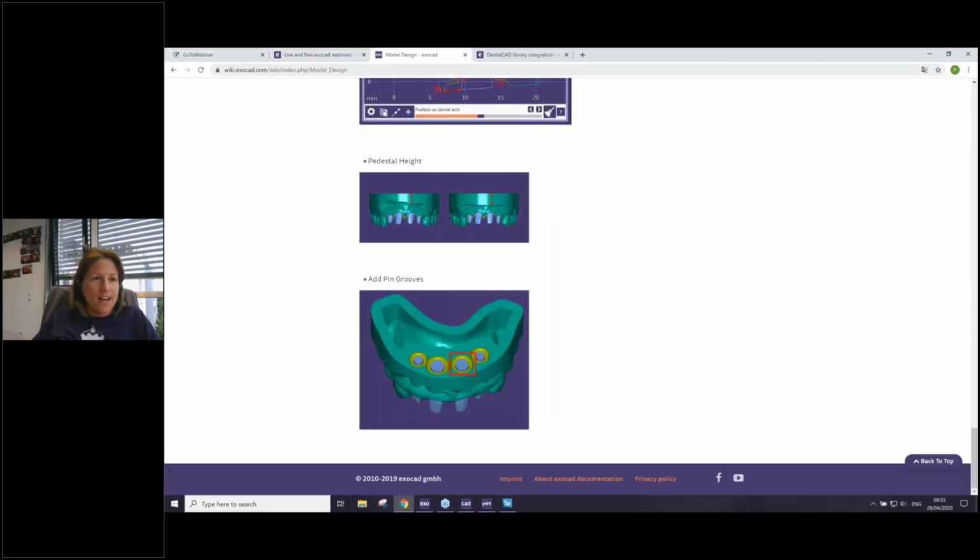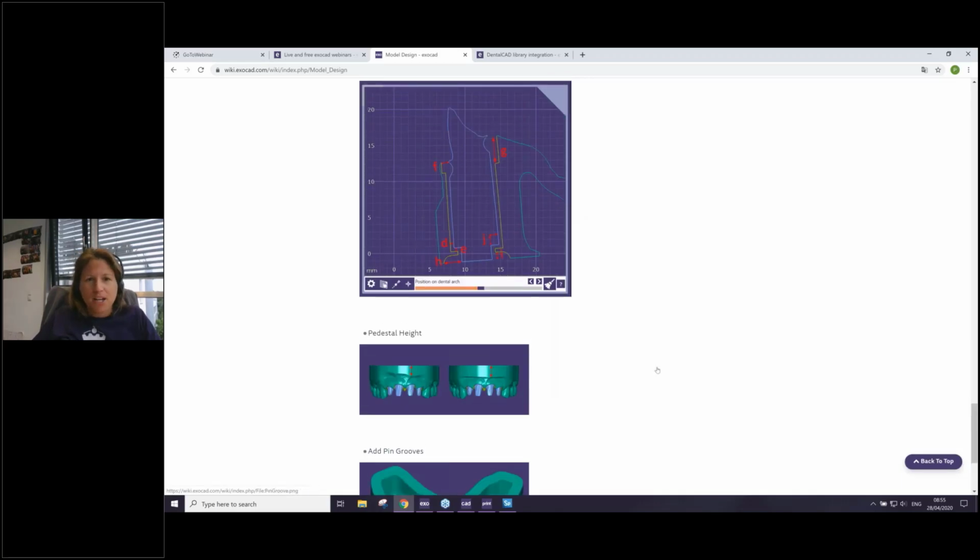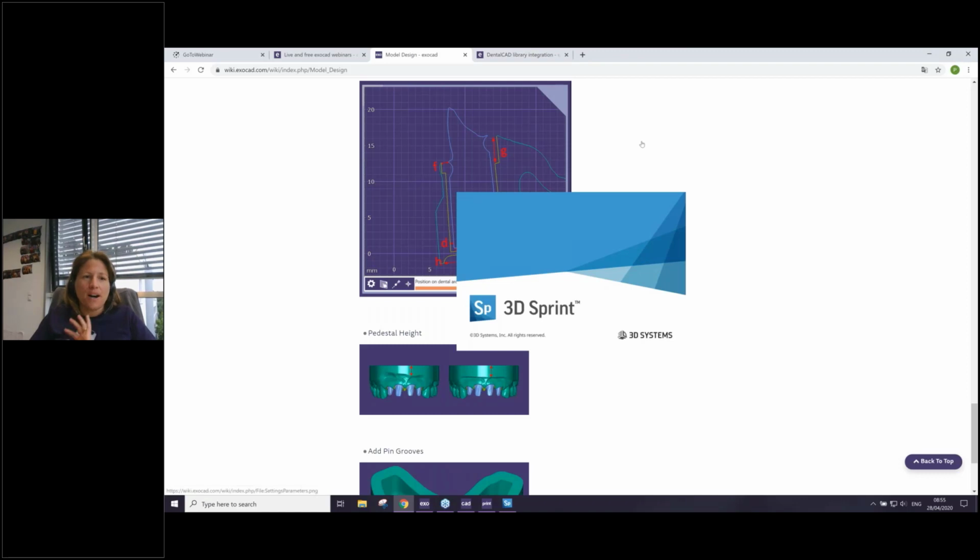And here in the exocad wiki we will have a nice explanation of the settings. I think we will also have another YouTube tutorial video, maybe at the end of this week or next week, which is also important to watch on YouTube.